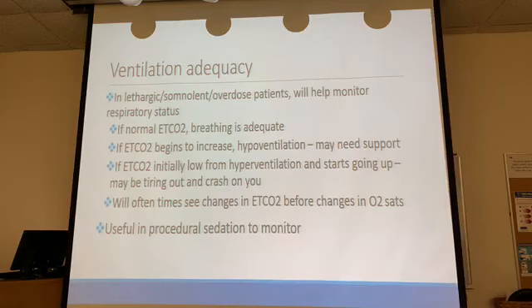You know, if you have a normal end-tidal CO2, that means they're getting a full adequate breath and they're exhaling adequate carbon dioxide. Let's say you pick up this patient and you're like, well, his sats are good. I think he's okay. I don't think I need to intubate him. But what if you're watching him, his end-tidal CO2 is 38, and as you're transporting, you start to see that end-tidal CO2 go up? What's going on?